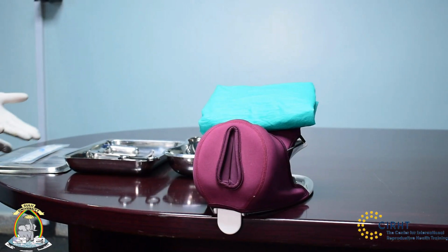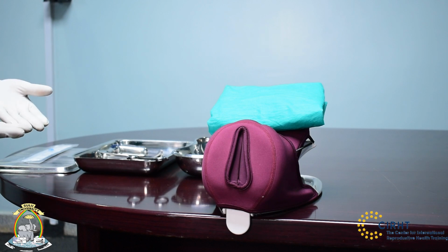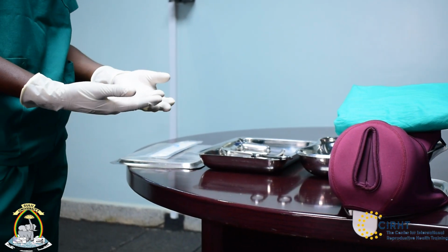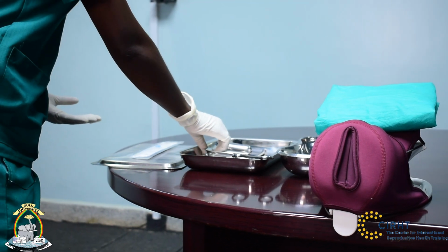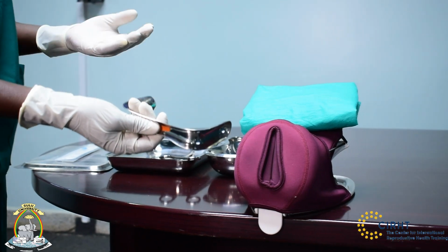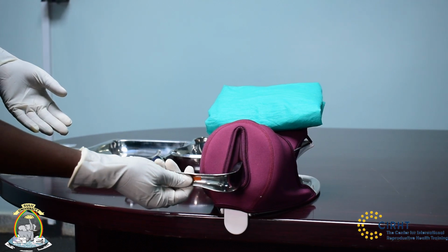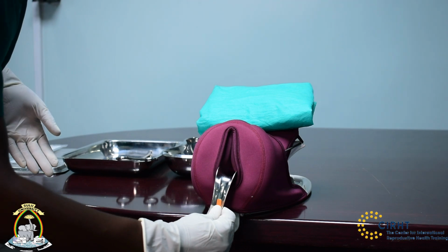Okay, so having set everything ready for the procedure, and we have also washed our hands and worn our sterile gloves, we will now start the procedure. So we will get our Sims speculum and gently insert the Sims speculum to visualize the cervix by depressing the posterior wall of the vagina. So we gently insert our Sims speculum.